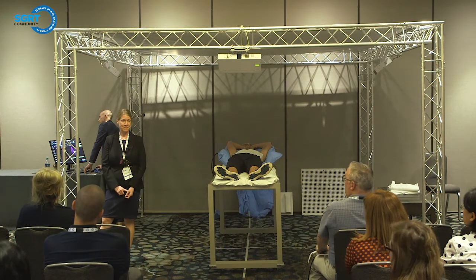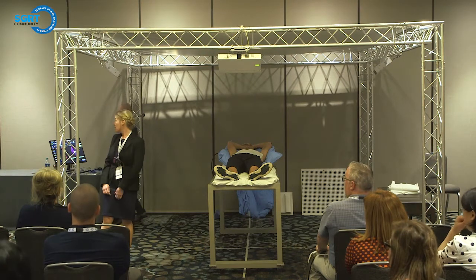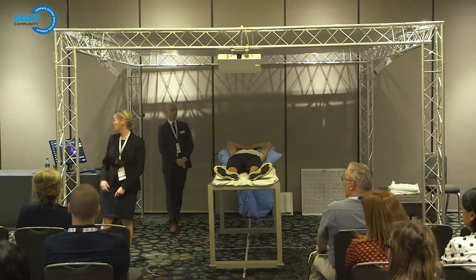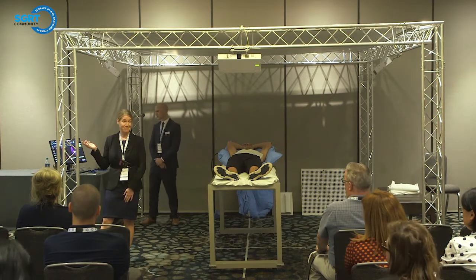How about during the middle of treatment? If you're at mid, let's say, and now you want to change it to dark, you can do that anytime.